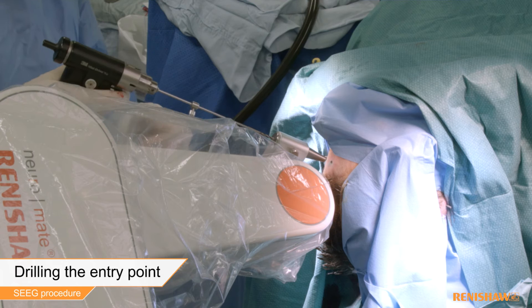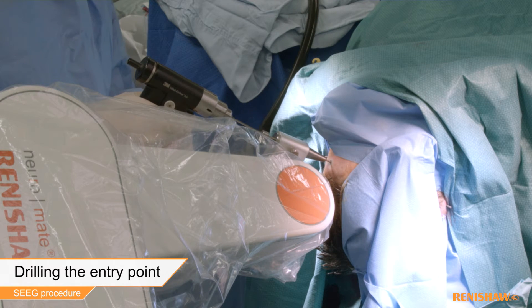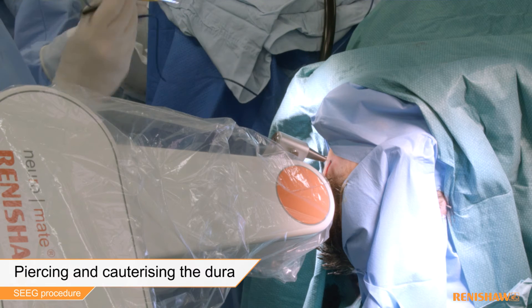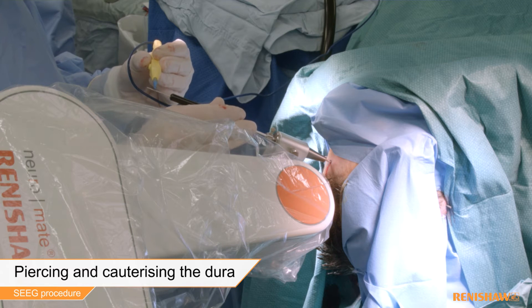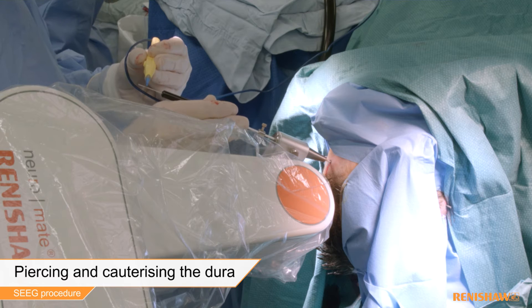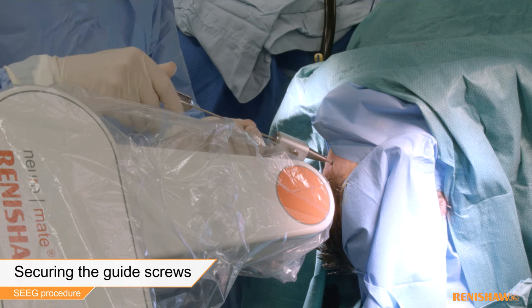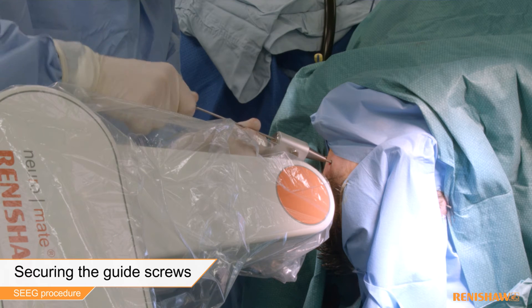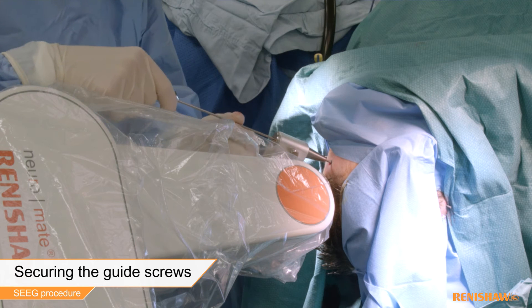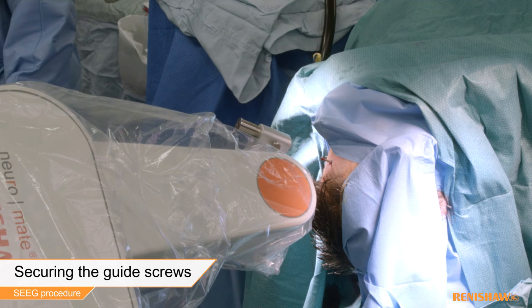The entry point on the patient's scalp is drilled and the dura pierced and cauterized. A guide screw is then located into the skull in line with the planned trajectory, and repeated for each trajectory.